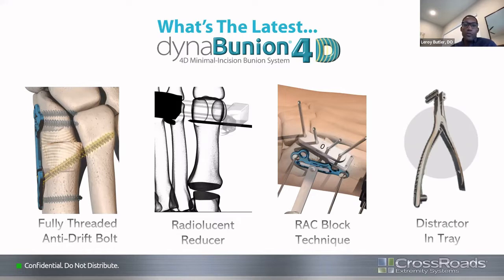The first update is the fully threaded anti-drift bolt. Previously it was a partially threaded bolt, but the newer system has a fully threaded design to give you better fixation across both metatarsals — not just threads going into the second metatarsal base. Next is the radiolucent reducer, which allows you to correct your pronation. After getting your frontal, transverse, and sagittal corrections, with the radiolucent reducer you're able to see reduced sesamoids. Previously the reducer blocked visualization somewhat, but now you can clearly see through the corrective arm.